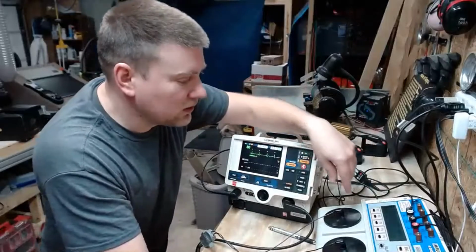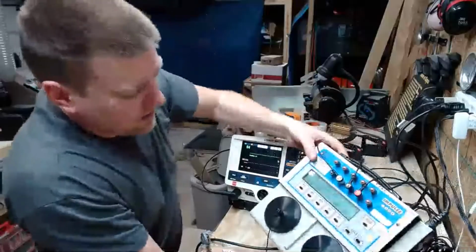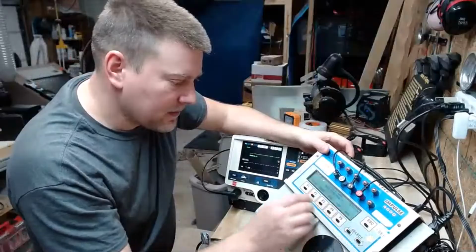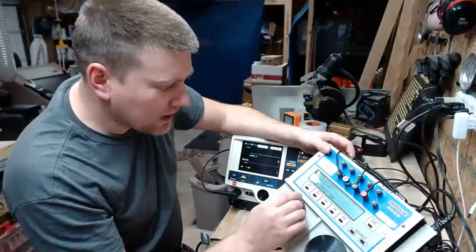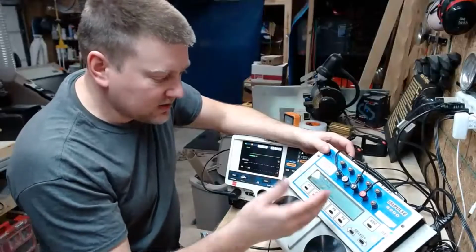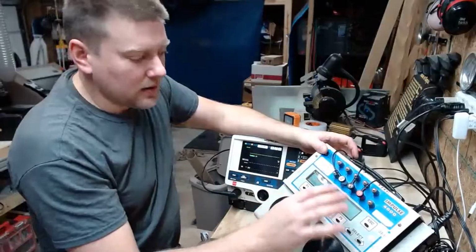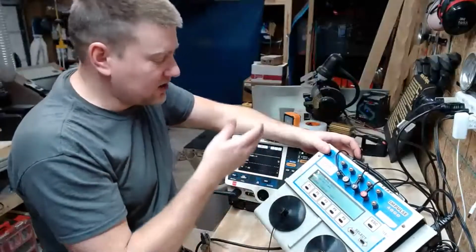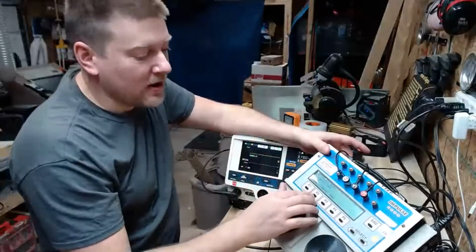So what I'm going to do is put my analyzer, I don't know if I can show this. I'm going to put it on Defib. No, I don't want to do that. And it gives me 3 settings. One of them is energy, one of them is cardio, and one of them is max. I've never done max. It's energy or cardio. Energy is when you want to take measurements and make sure that it's not off.